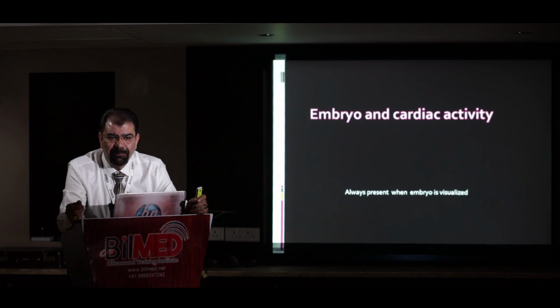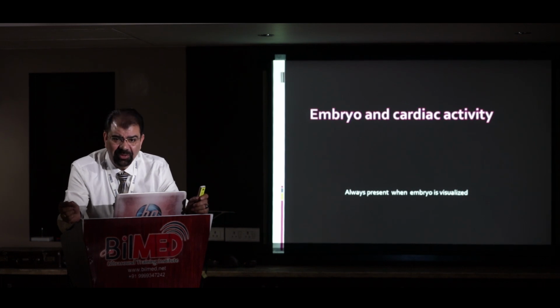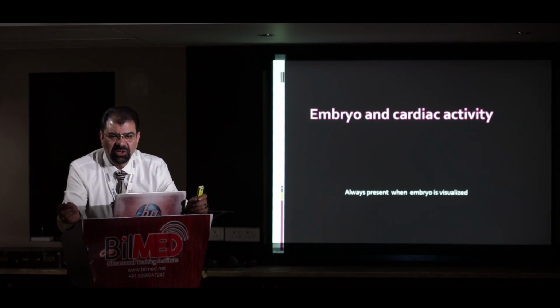Now, if I apply the whole of my physics there, I can even see a fetus which is not visualized on its own. So the point is not that you have to go to that depth. The point is that it is there, and there only. Now you have to make all attempts first to see it. Please, whatever physics you know, apply it. For example, what you have to do? You have to adjust the depth first.